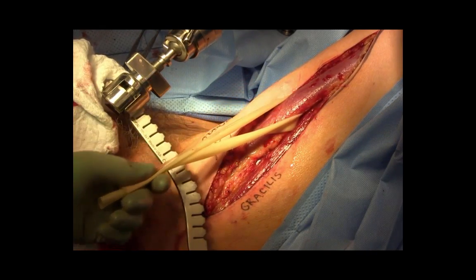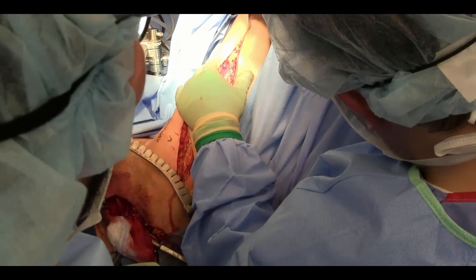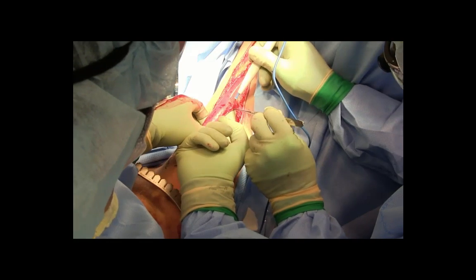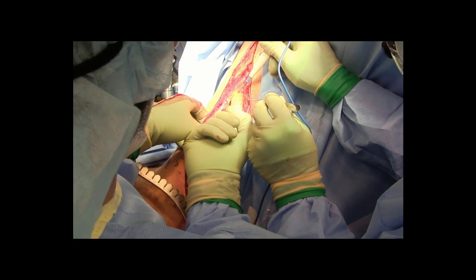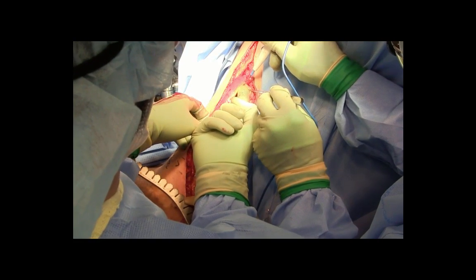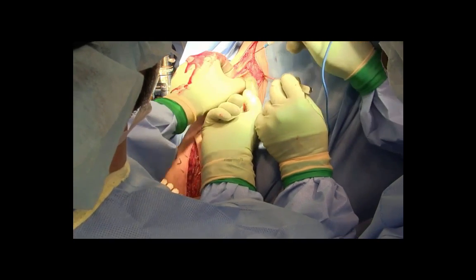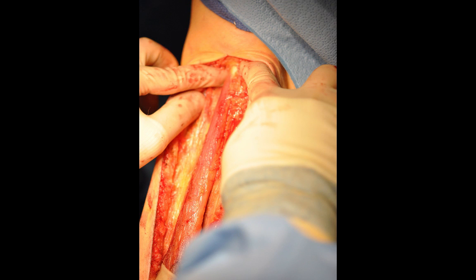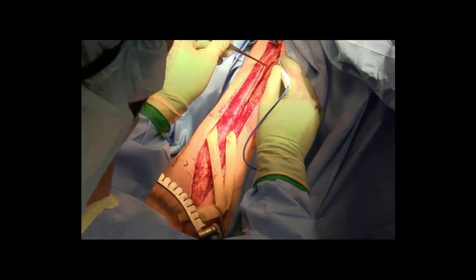The incision is now carried forward up to the tendinous attachment, which will be found at the inner knee. The lower aspect of the muscle can be detached with bovicautery with impunity, as most of the minor pedicles all arise from the superior aspect of the muscle. This is carried forward up to the knee. Here's a photograph of the tendinous attachment at the inner aspect of the knee. The tendinous attachments are now detached with bovicautery.